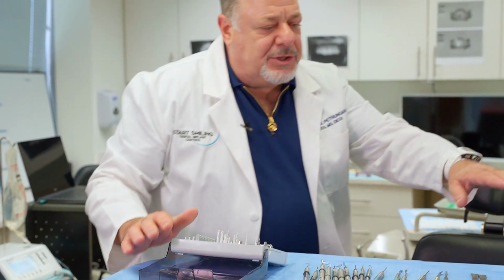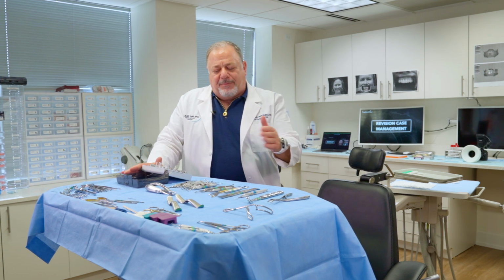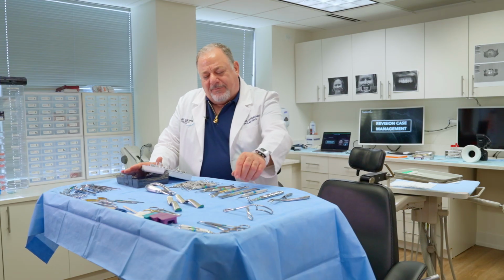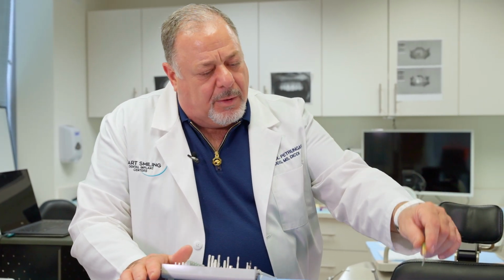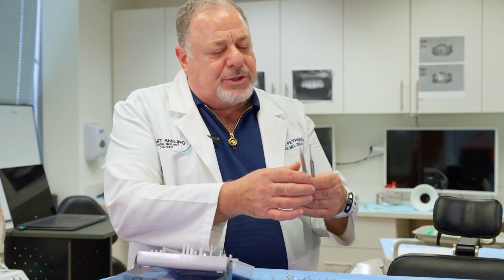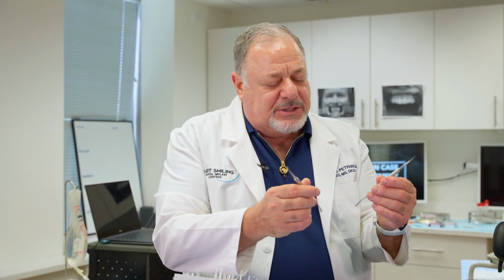We have our rongeurs, our mirrors, our elevators, and again here, depending on the quality of the tissue, thickness, biotype, phenotype of the tissues, we're going to have multiple elevators available to us, whether we have a Prichard elevator, which is a standard periodontal elevator, or we go to a more general oral surgical elevator, a periosteal, or we start getting into finer elevators, which are ones I designed, called the Petro 1 and 2 from Salvin. They're much finer.